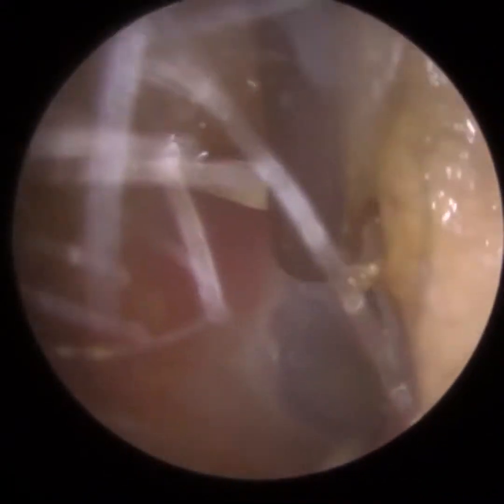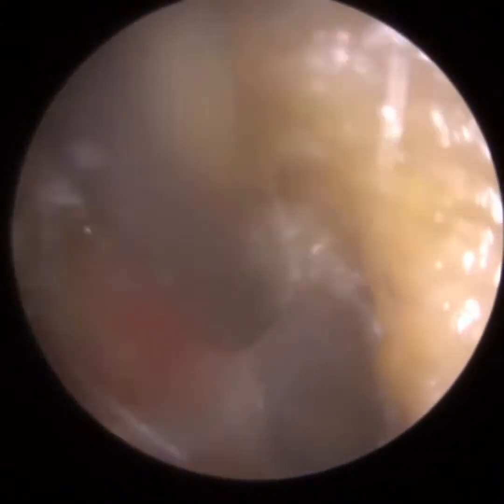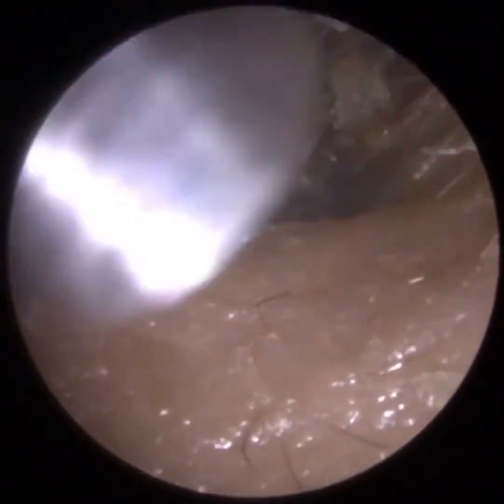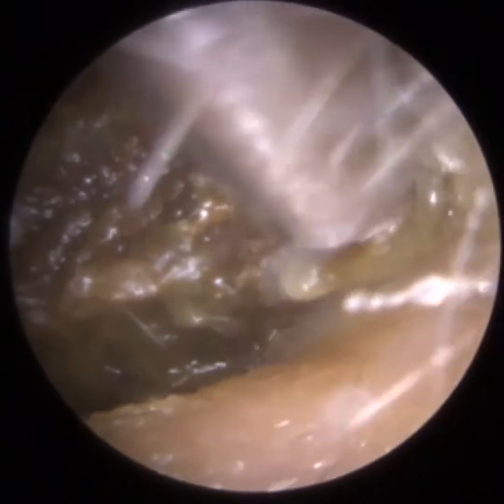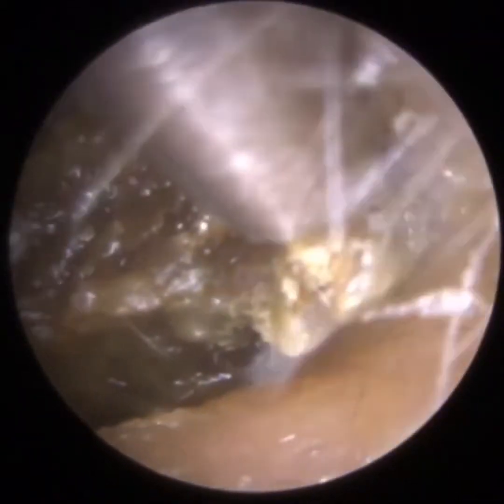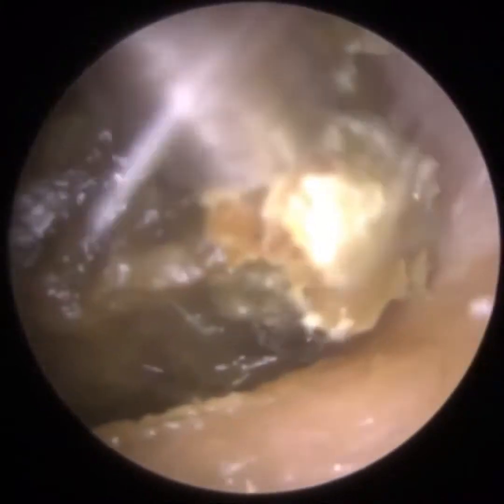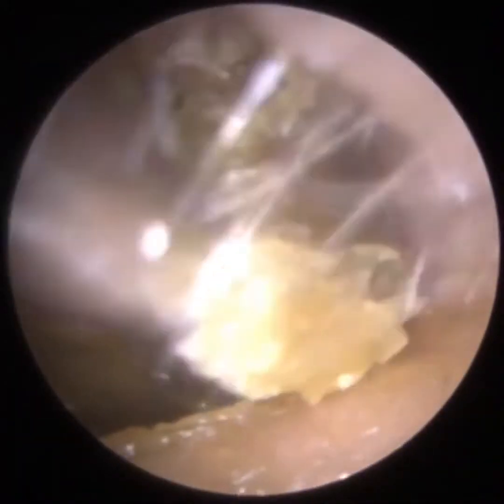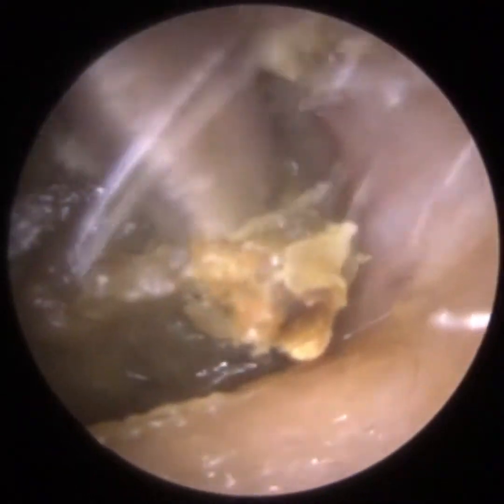For any earwax removal specialists watching the videos, you have probably seen a trend in my procedures that I always target this weak spot, which is at the rear of the entrance of the ear canal. There's a little blind spot, should I say, if I can get my words out. So again here, this is the patient's left ear, so we're on the posterior, the back part of the ear canal, on the lateral canal wall. If you can lift the plug of wax off this canal wall, it really does help the rest of the procedure. And this wax was a bit firmer, a bit crustier in consistency, and again, I'm just trying to lift it off the canal wall.